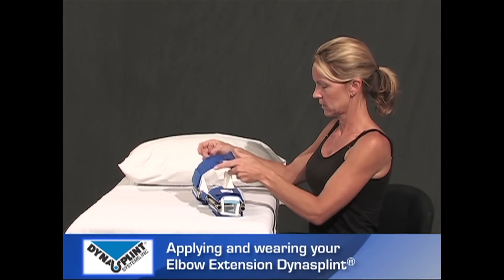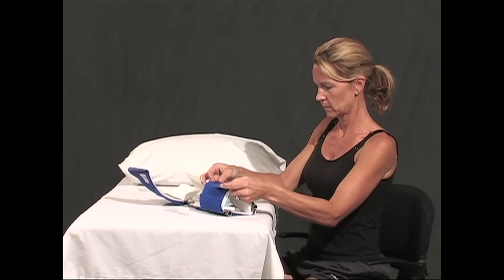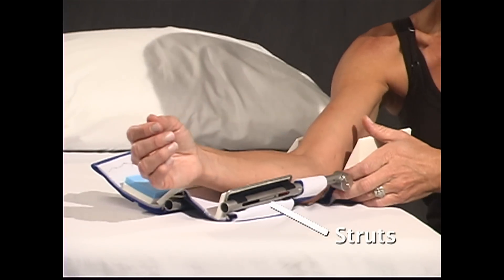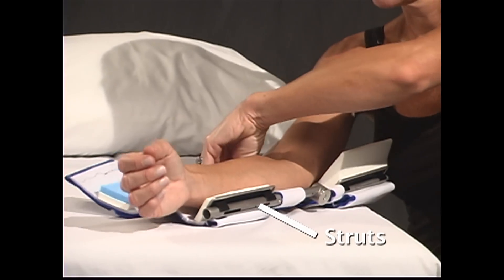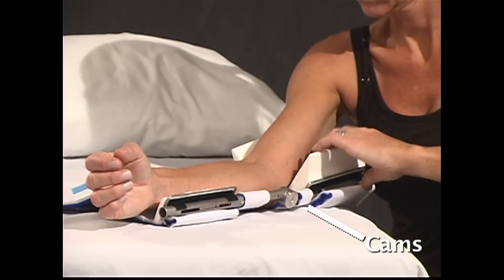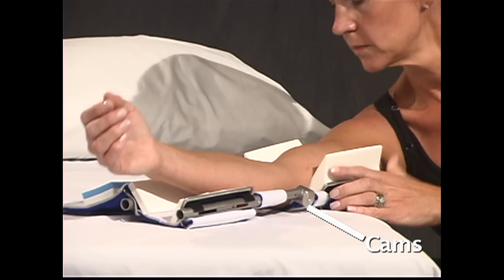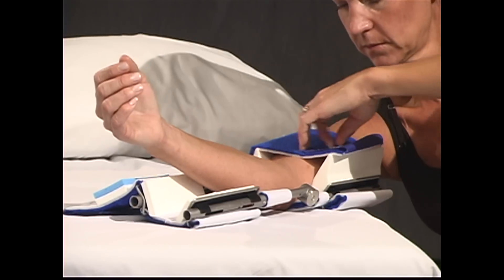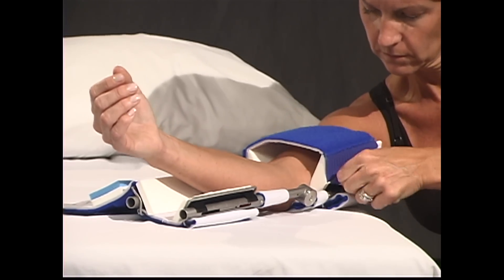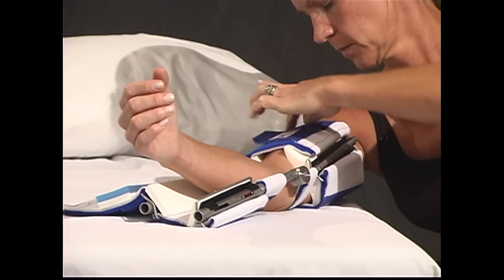Completely open the front of the upper arm cuff and top of the forearm cuff. Lay your arm inside the unit while seated at a table. The larger struts with windows and scales should be placed on the lower arm. Align the cams with the elbow joint — in other words, the circles will be next to your elbow. Attach the DynaSplint system to the arm by feeding the front of the upper arm cuff through the D-wire on the opposite side. Pull back hard and fasten the Velcro sides together.